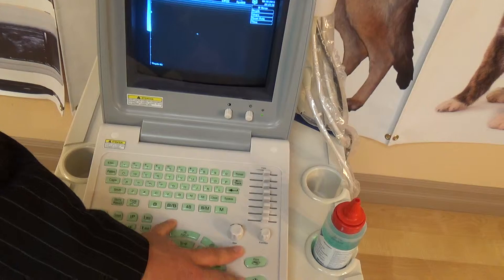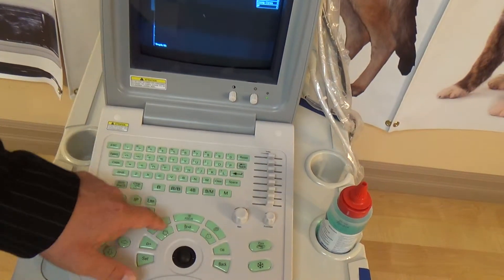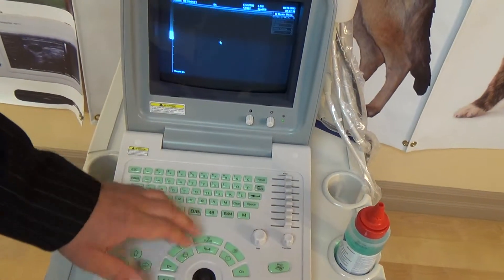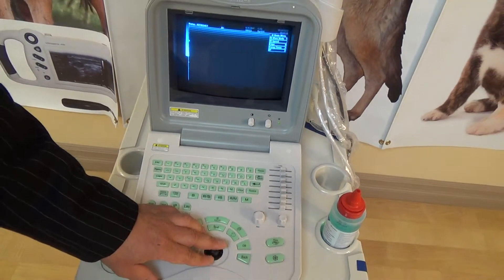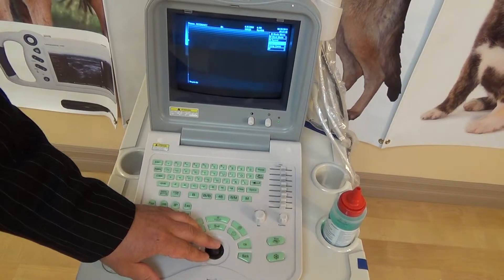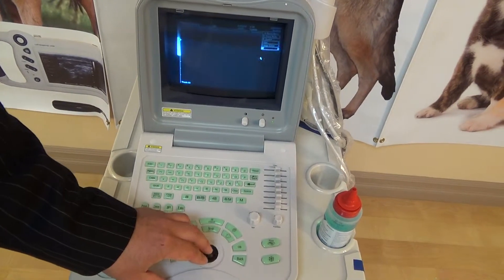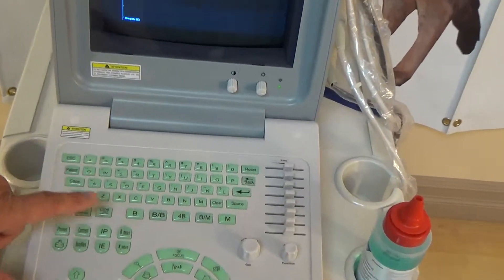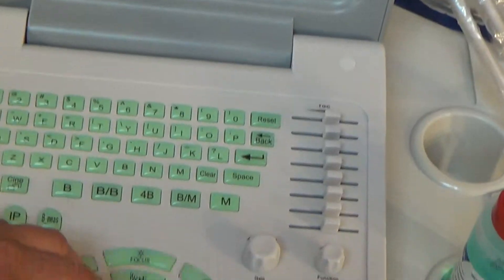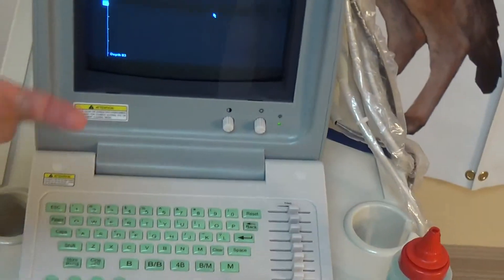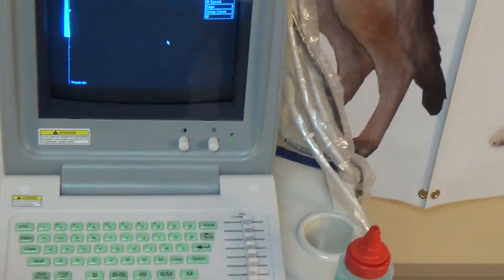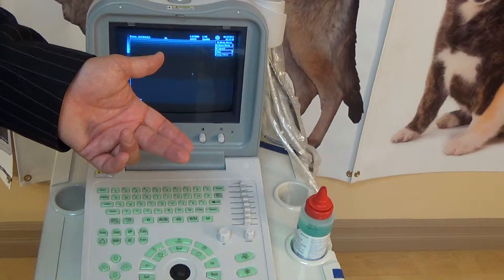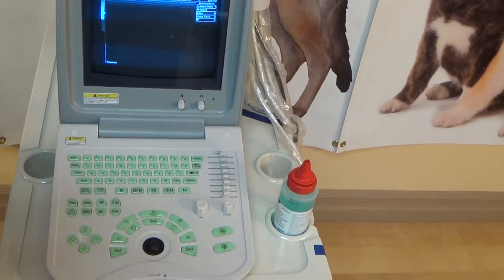Going back to B-mode, something I forgot to mention: when you freeze and go into measurements, aside from distance, you can also do things like ellipses and calculation packages for OB settings. So you can measure everything you really need to measure.